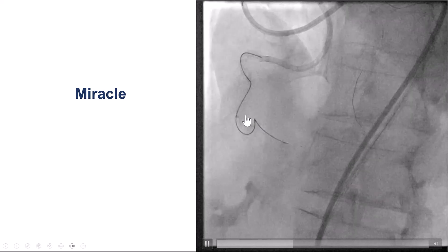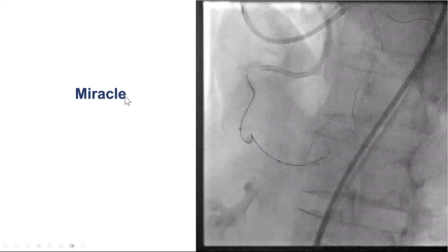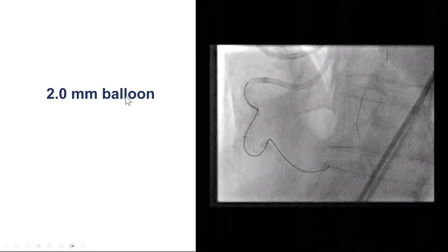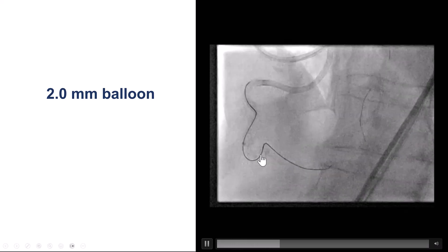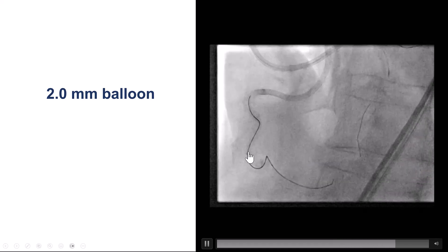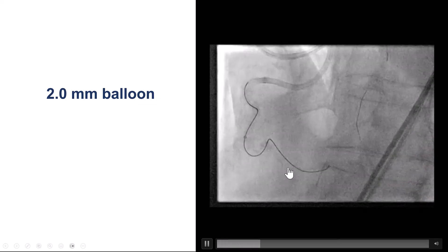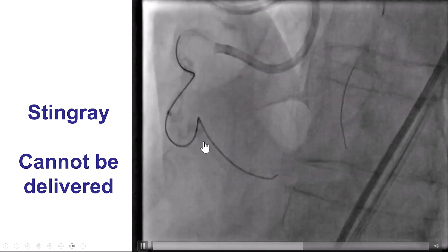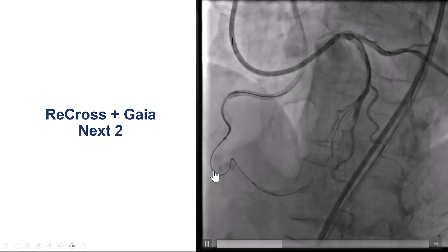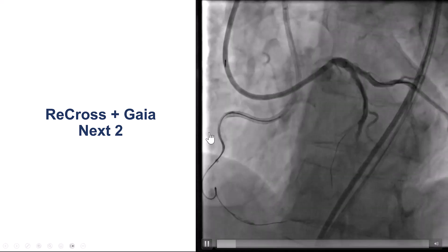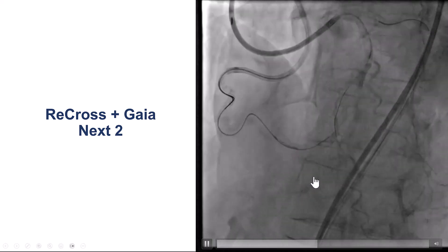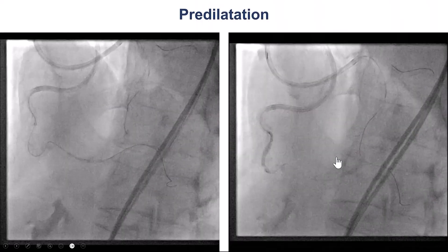Knowing that equipment delivery would be challenging, we exchanged the Mongo for a Miracle wire to provide more support, and pre-dilated using a 2.0 mm balloon. There is always a fine balance between facilitating delivery of re-entry equipment and minimizing hematoma formation. Unfortunately, the Stingray balloon could not be delivered — it was stuck prior to the significant bend. So after multiple attempts, we switched to the ReCross, which is the only dual-lumen microcatheter with two over-the-wire lumens. Using the ReCross and a Guidezilla X2, we were able to enter the distal true lumen, as confirmed on contralateral injections.